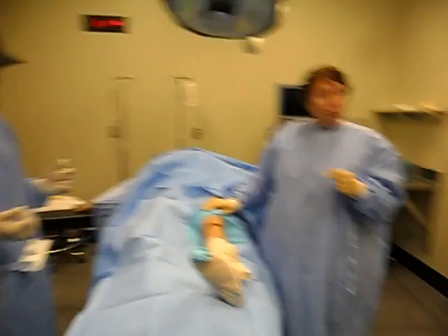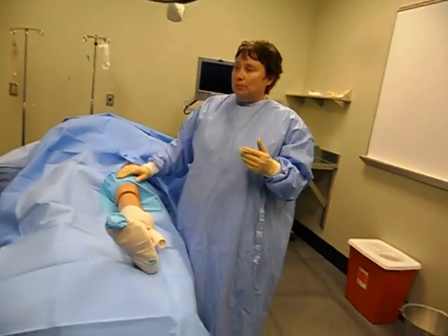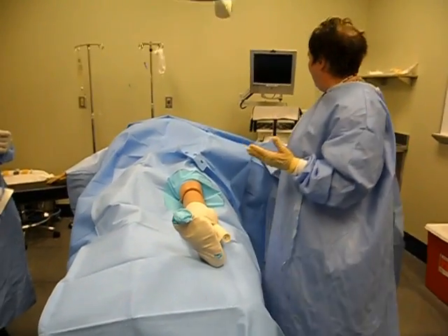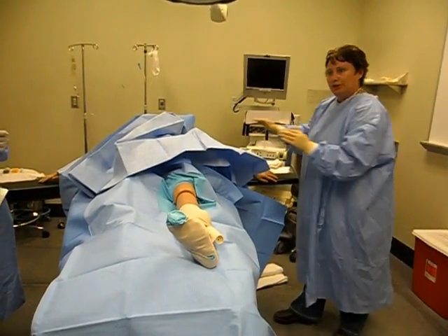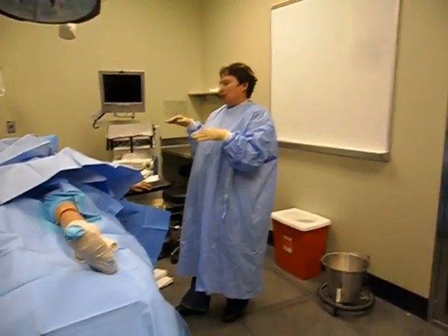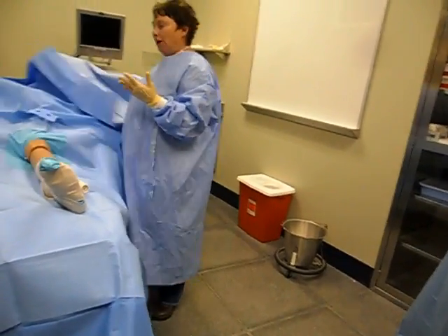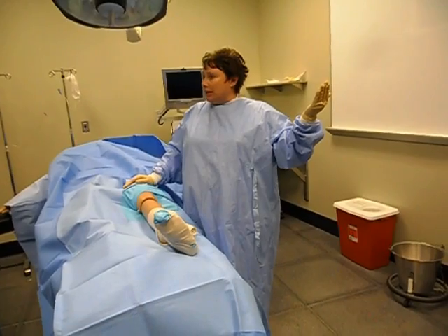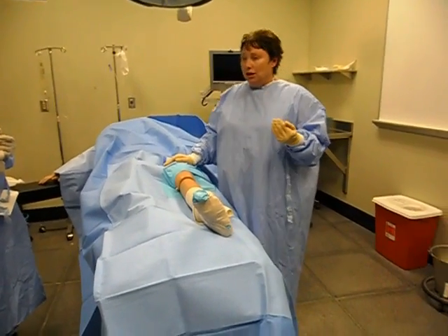This would really be no different for an arm. If you were doing an arm, we have what we call an arm table — about the width of the foot of the bed or two arm boards together. So if we had done an arm, someone would hold the arm, we'd put a sheet underneath, wrap the tourniquet in a towel, put a stockinette over the hand with an Ace or S-Mark, and then put a fenestrated drape over the arm. Go ahead and practice arms or legs on the mannequin or a volunteer.